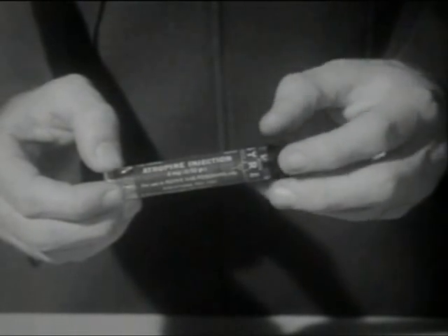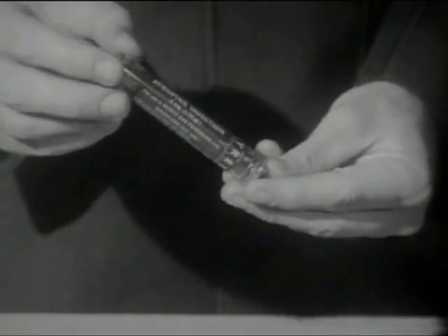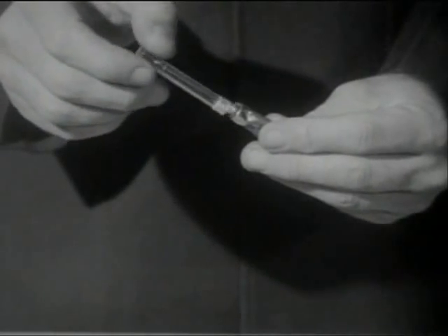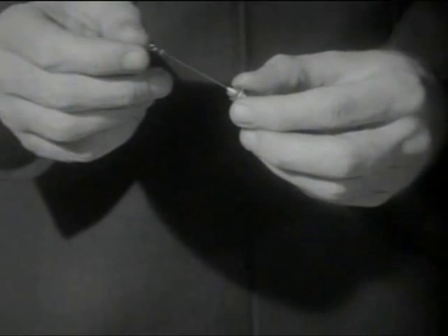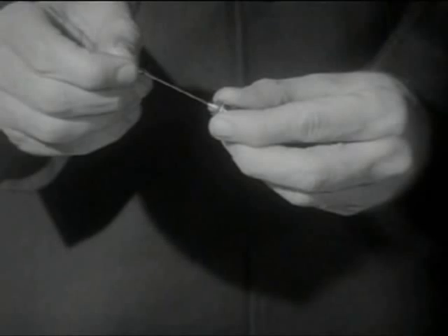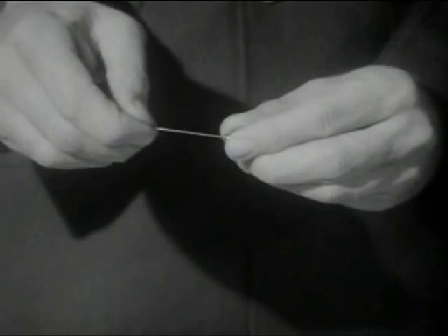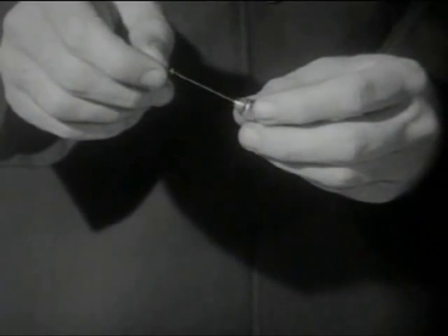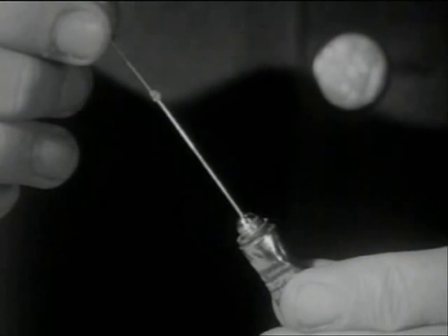The injection procedure for the atropine Syrette is somewhat different. The Syrette is removed from its container. The plastic cover is unscrewed and discarded. The wire loop is pressed down firmly with a twisting motion as far as it will go — this will pierce the inner seal at the base of the needle. To make sure the seal has been broken, the tube is then gently squeezed from the bottom until a drop of the liquid solution appears at the tip of the needle.